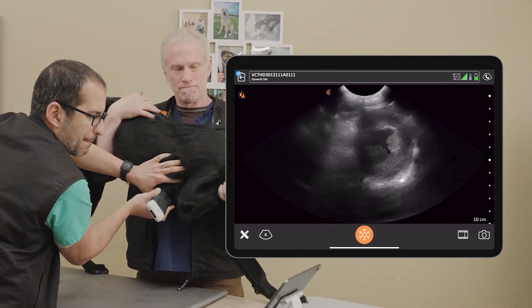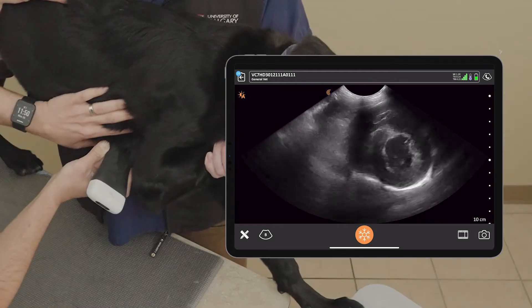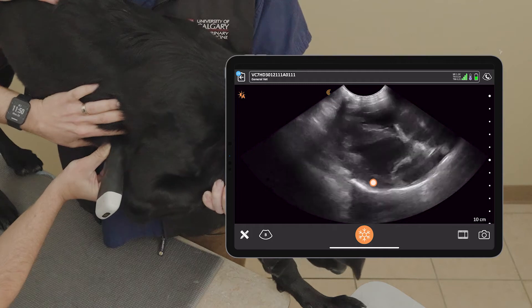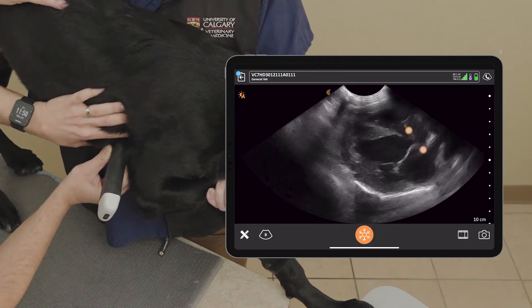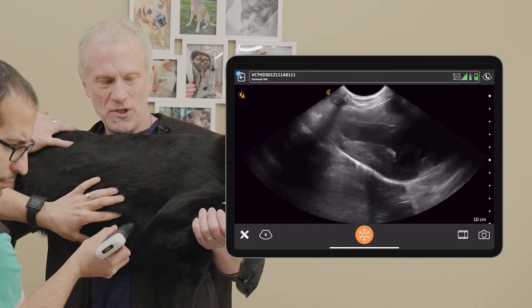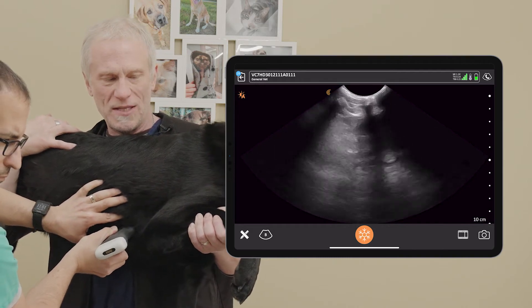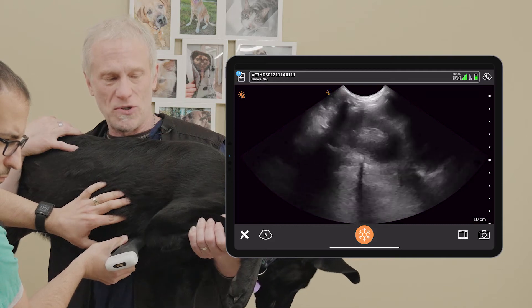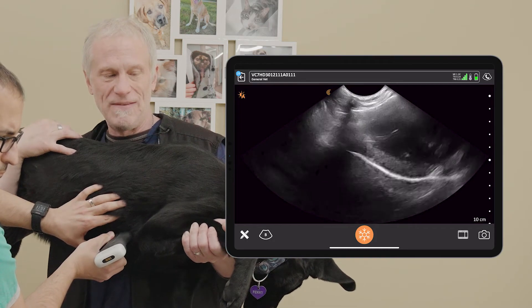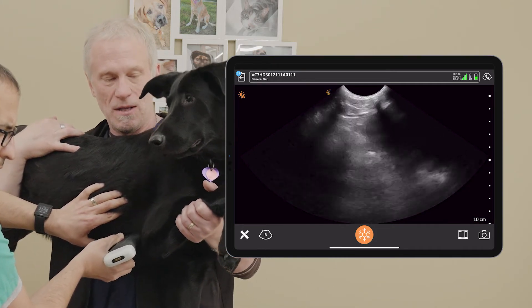For the four-chamber view, we go back to that mushroom and we want to hit it relatively well — not too far. We rotate the probe 90 degrees and now we're in long axis and we can see the four chambers: the left ventricle, the left atrium, the right ventricle, and the right atrium. We rotate a little just to expand that left ventricle. We can see the left ventricle and the right ventricle a little bit in the near field. We're looking for obvious changes with right-side heart failure — pulmonary hypertension where the right ventricle is larger than the left ventricle, and the right ventricular free wall is larger than the left ventricular free wall. The intraventricular septum will sometimes deviate towards the left side with right heart pulmonary hypertension. That's our four-chamber long axis view.